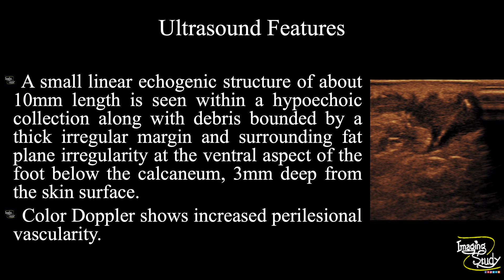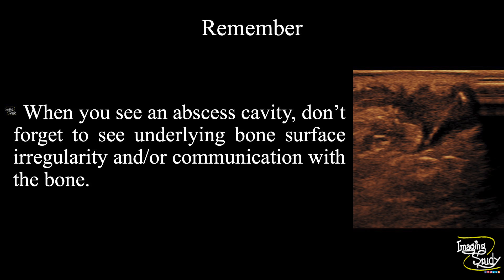In summary, a small linear echogenic structure of about 10 millimeters in length is seen within a hypoechoic collection along with debris, bounded by a thick irregular margin and surrounding fat plane irregularity at the ventral aspect of the foot below the calcaneum. The most superficial part of the fish bone was around three millimeters deep to the skin surface. Color Doppler shows increased perifocal vascularity. These features conclude this as a case of foreign body granuloma due to fish bone impaction with abscess formation. The take-home message: when you see an abscess cavity, don't forget to check the underlying bone — it may show irregularity with or without communication with the abscess cavity, as the inflammatory process may also involve adjacent bone if it persists for a long time.